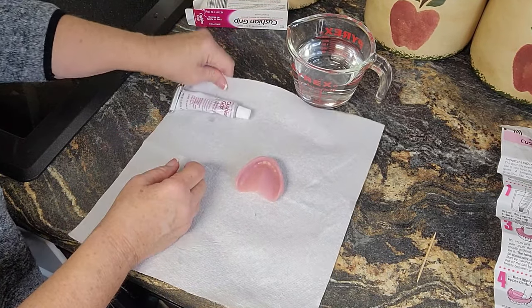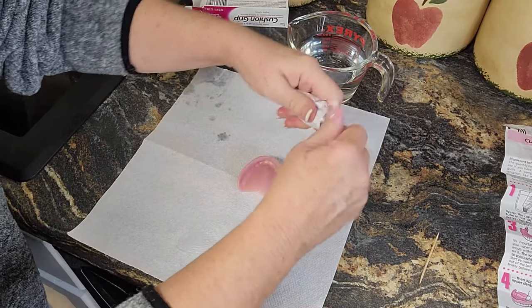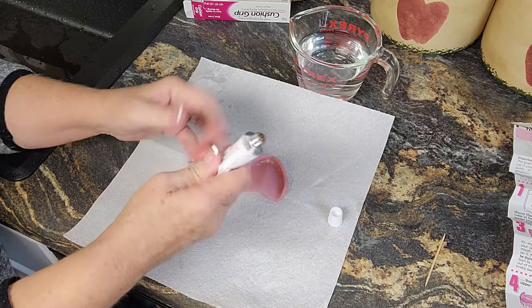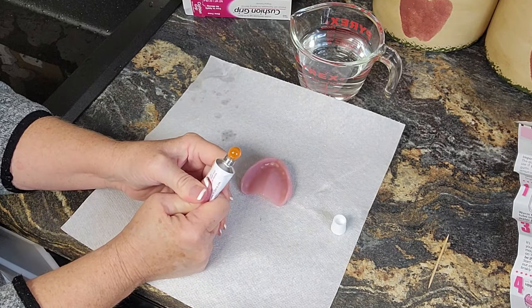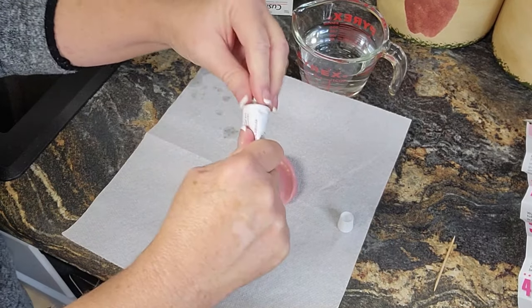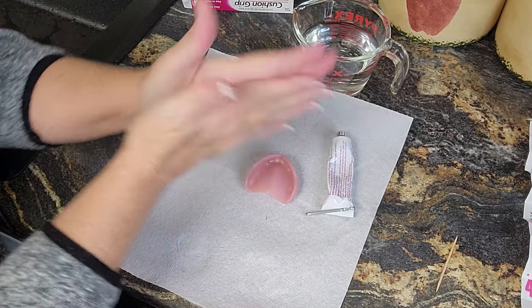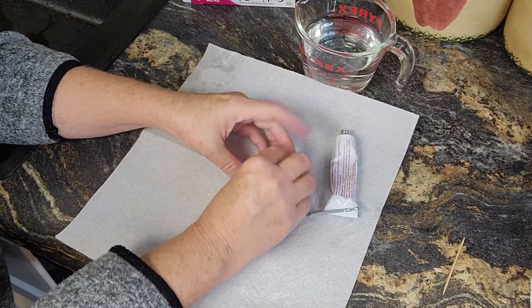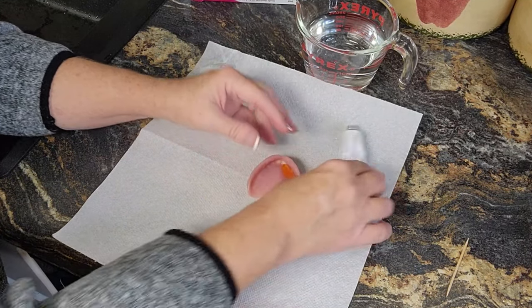Get the cushion grip out, dry your fingers, and squeeze out a big ball. We're going to do a big ball here — see that — and then roll it into a hot dog shape. Place it in your denture, just place that in your denture.